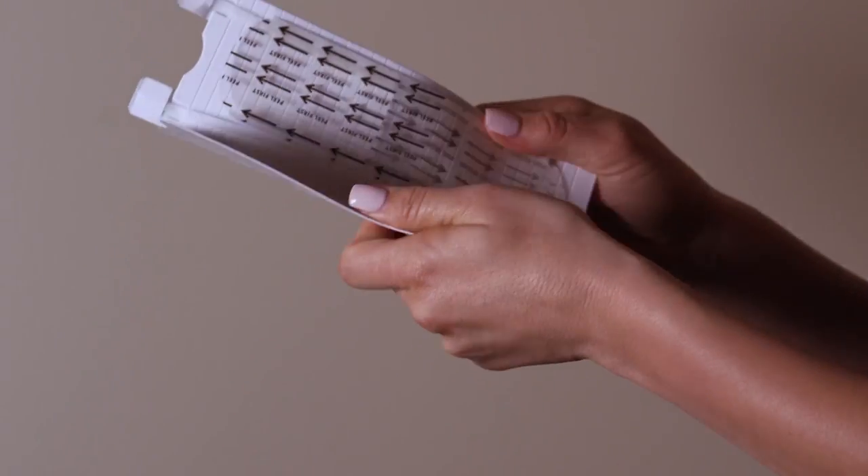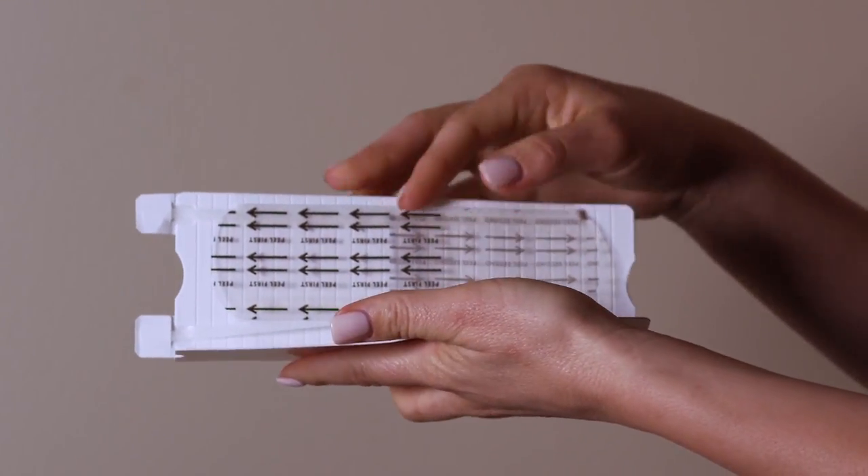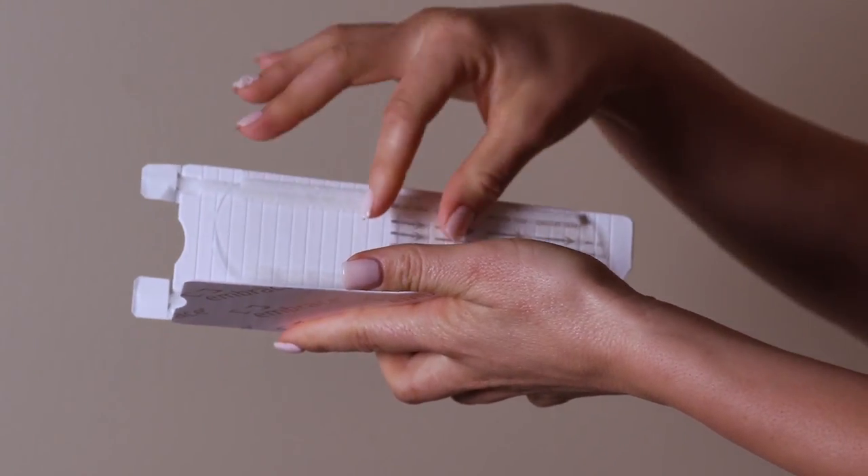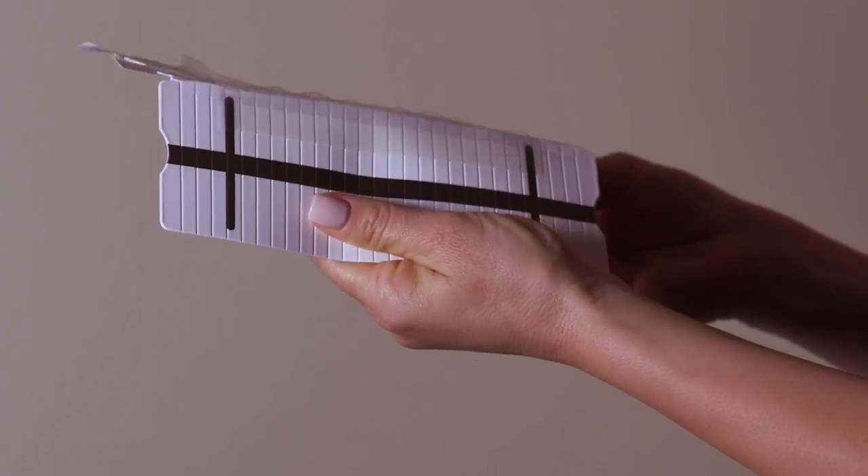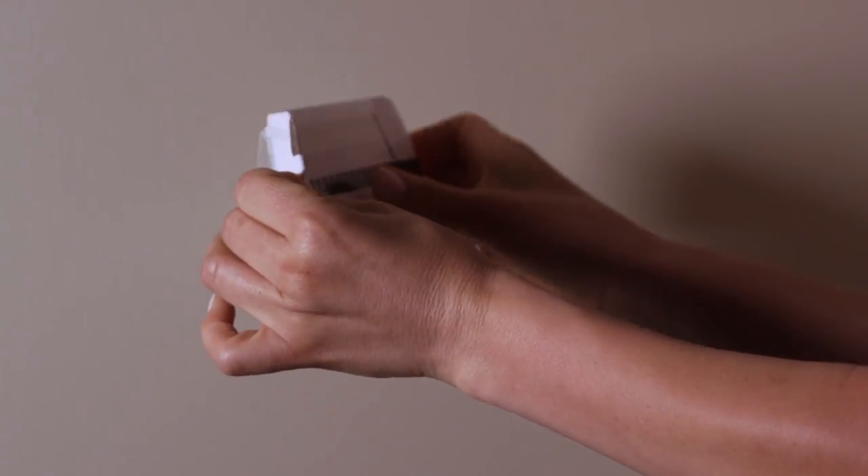Partially open the applicator and peel away the protective liners. Be careful not to touch the exposed adhesive. Next, fold the side of the applicator with the dark stripe all the way back and gently bend the applicator.